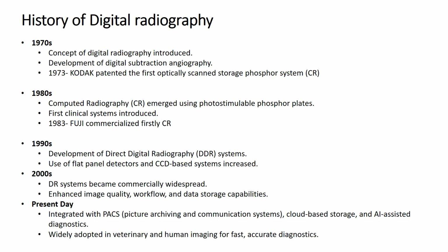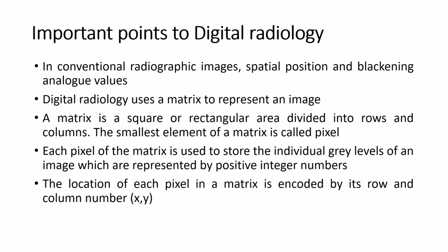In present day, the DR as well as the CR system is integrated with many communication systems like PACS, Picture Archiving and Communication System, or cloud based storage and AI assisted diagnostics. It is widely adopted in veterinary and human imaging for fast and accurate diagnostics.